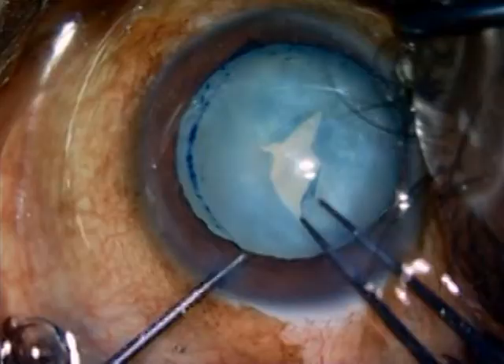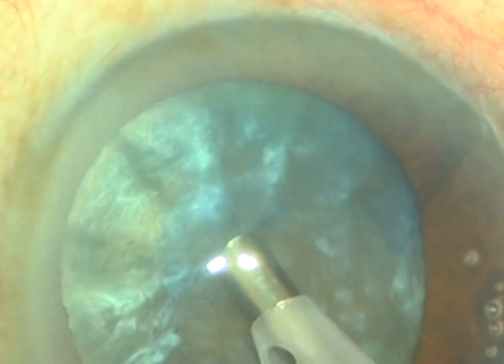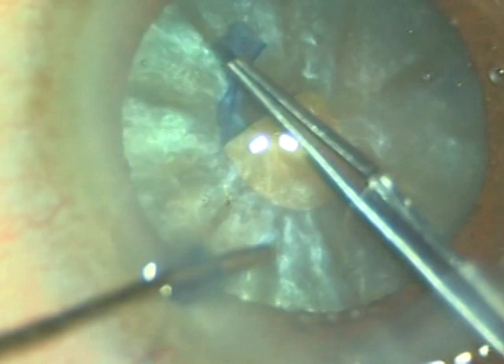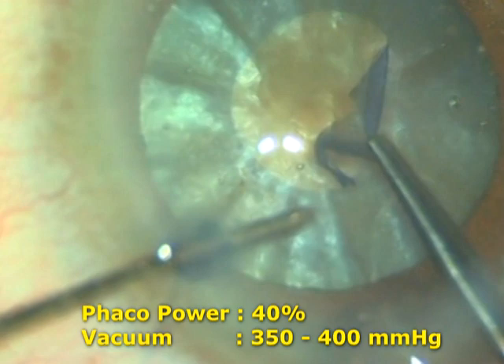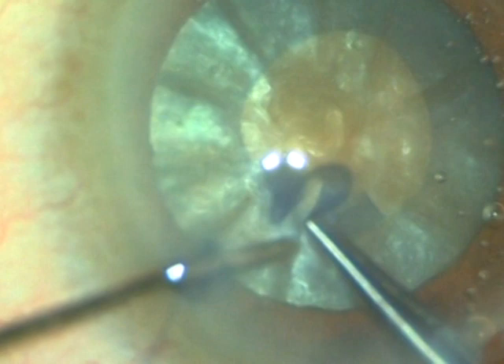To prevent this Argentina flag sign, I developed a technique called the punchorrhexis. A straight tip, either 15 degree or 0 degree, with bevel down, is directed towards the center of the anterior capsule, and a sudden burst of phaco emulsification is applied. The phaco power is approximately 40%, and a vacuum of around 350 to 400 mmHg is given. Because of the sudden burst of phaco emulsification, there is a sudden decompression of the bag, and the Argentina flag sign does not occur.